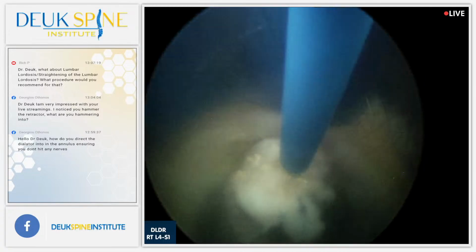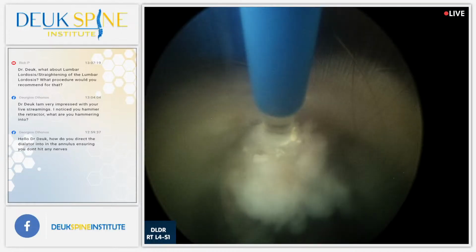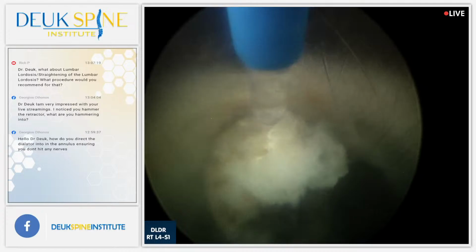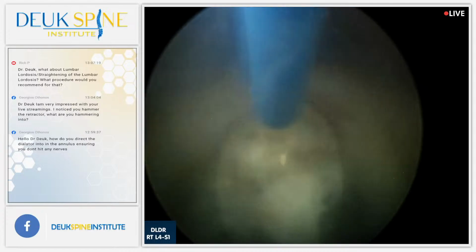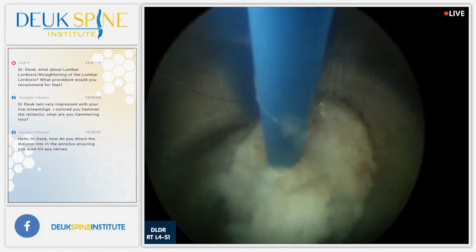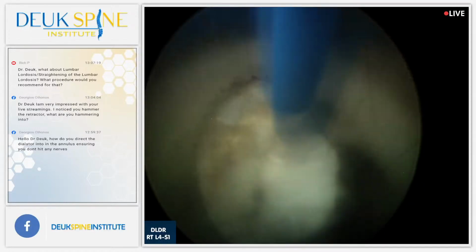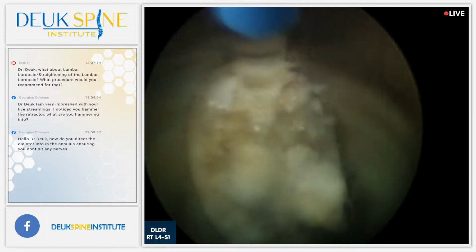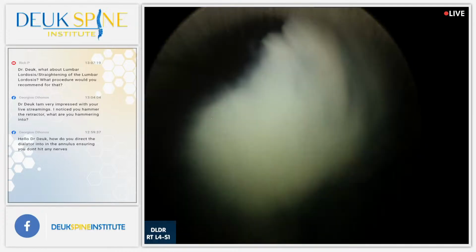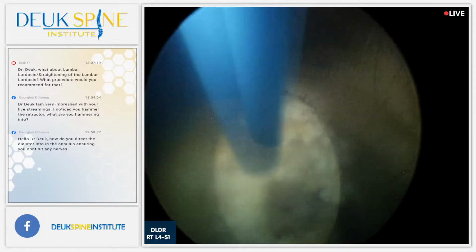There's another piece of herniation. Look at the red color. You guys see the inflammation? We showed you a video on how the herniated disc causes inflammation. The inflammation is red. If you look at the video, it's pinkish red. That's because it's got a lot of blood supply. Same as a zit on your face. Any kind of inflammation in your body has a lot of blood supply, so it turns red. That's what we're seeing. Normally the disc is white, but this is red.